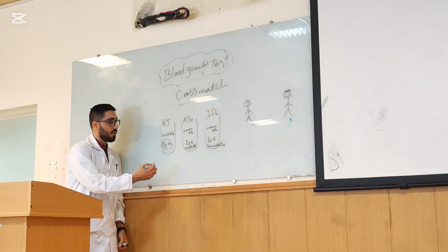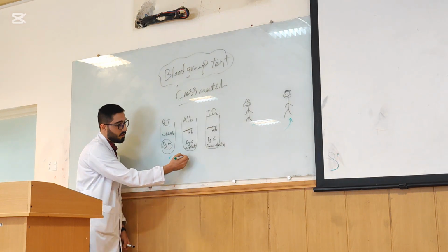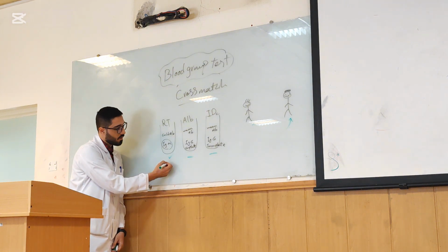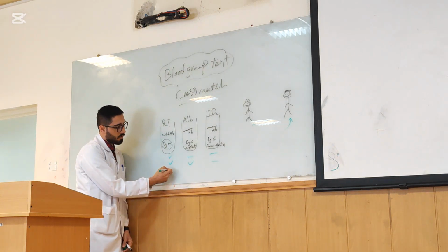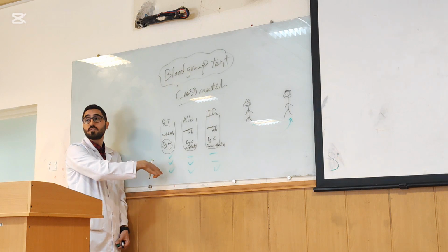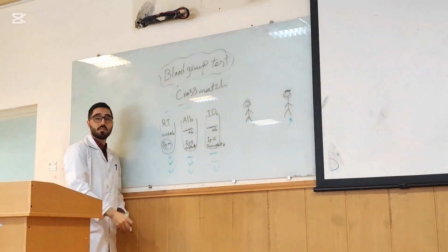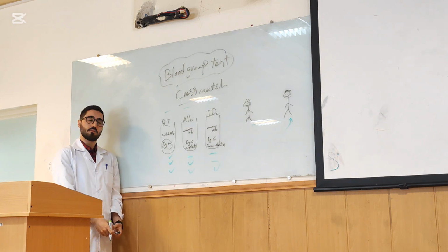Here we have agglutination with this one, no. This one, no. In all of the tubes we have no agglutination, okay? Allow transfusion? Yes. Okay.